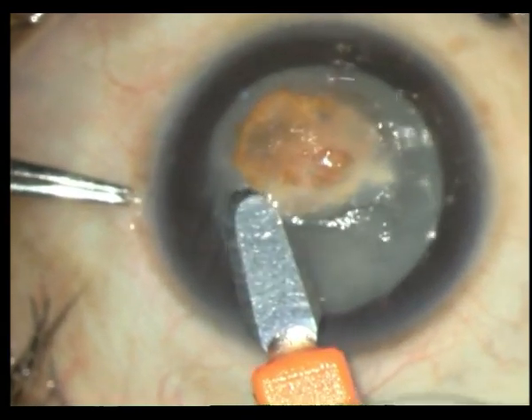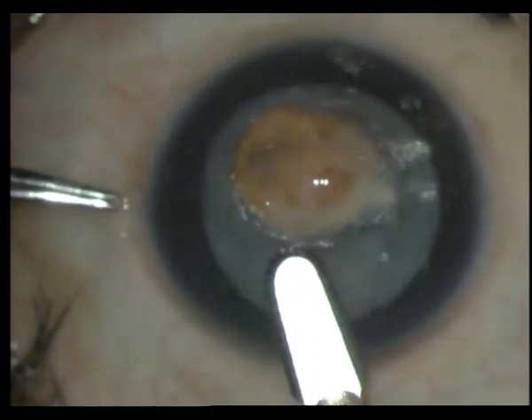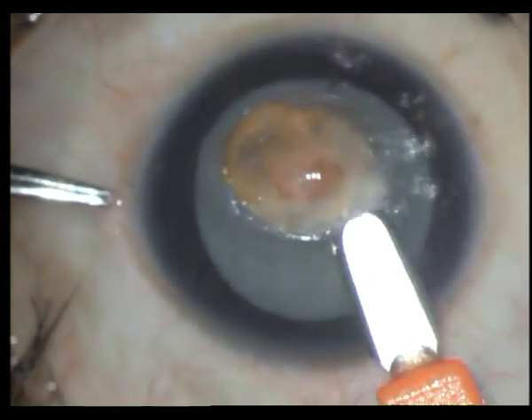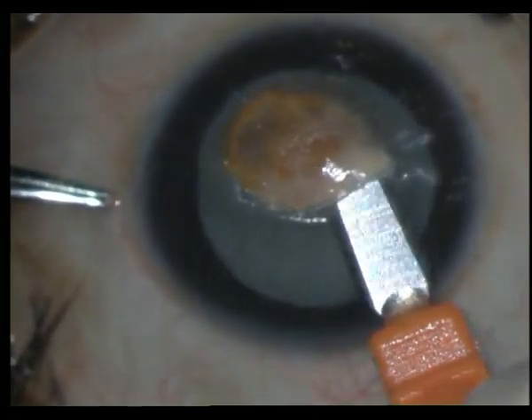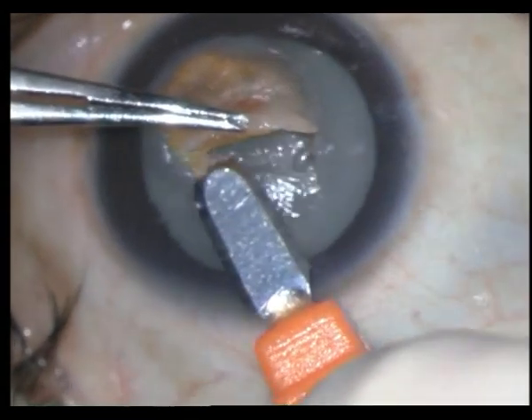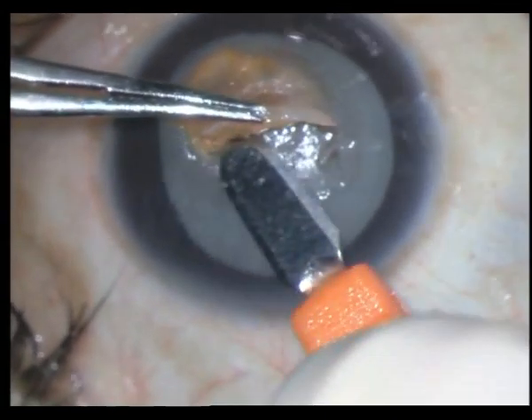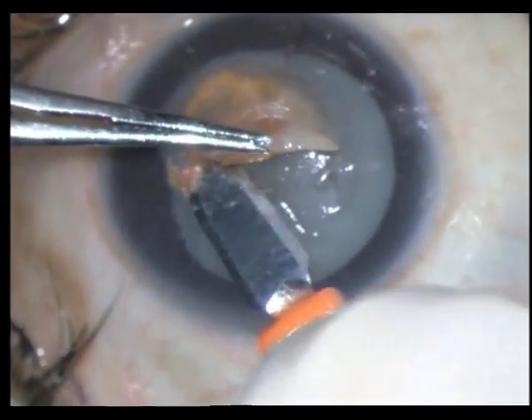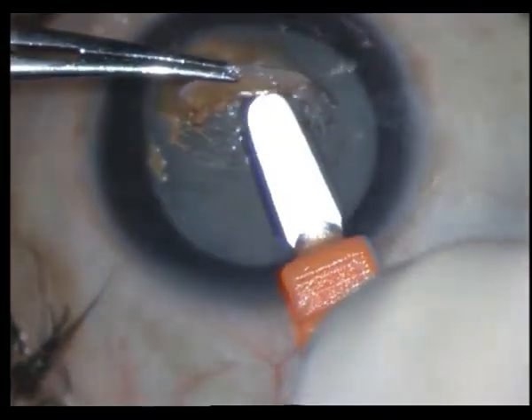Here initially I am dissecting what one could call a corneal keloid — almost — but it is more of a dystrophy with some hyaline degeneration. Make sure your dissection is smooth. Many of these patients, if you can do a superficial keratectomy and handle the cataract, you can avoid the corneal transplant.